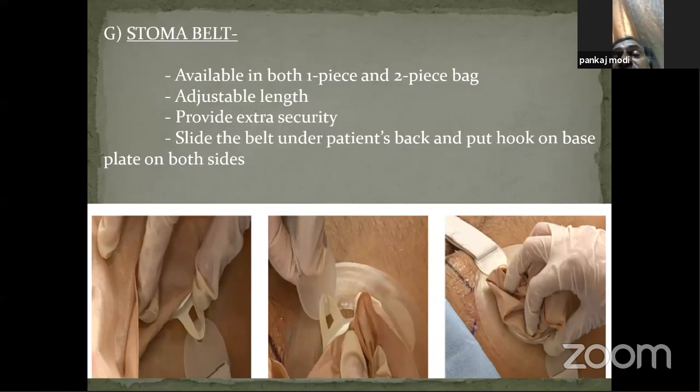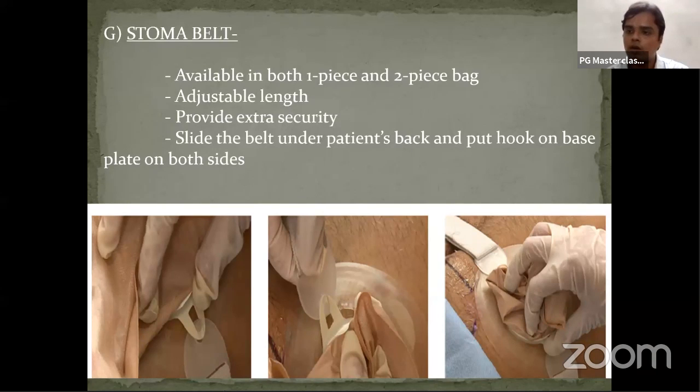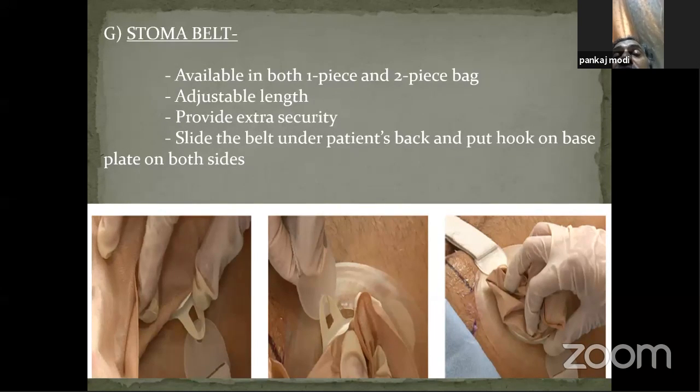So remember, the flanges are over. And what is the third part? The bags. How do you apply the flange to the bag? One you have said is a locking system. What other system? There is one flange where the simple bag can be tied over by a rubber band. You can pass a rubber band and that will remain in position. Easiest way. You understand? Again, very cheap.